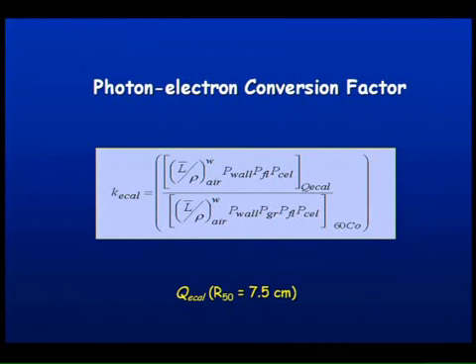Notice here, in the denominator, there is this P gradient. Yesterday you heard P replacement. P replacement really is a product of these two terms, P gradient and P fluence. So the gradient effect, the term P gradient, has been taken out of this, and it's in the main equation for the dose equation. So for every chamber at a given beam quality, all of these have a fixed value. So the K cal for a given chamber is unique.